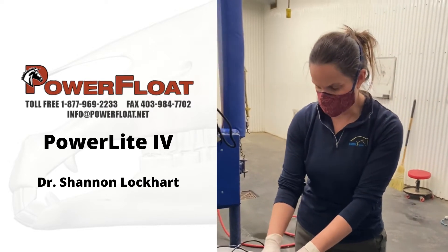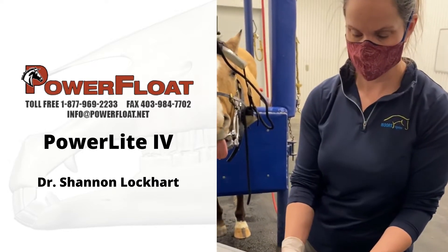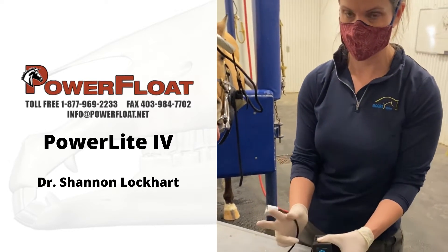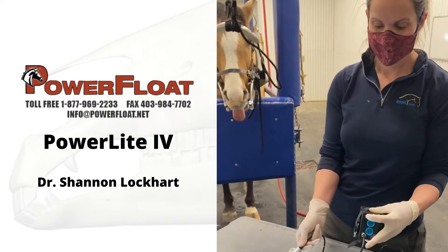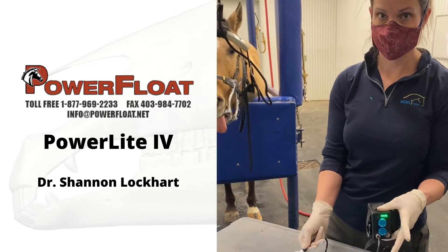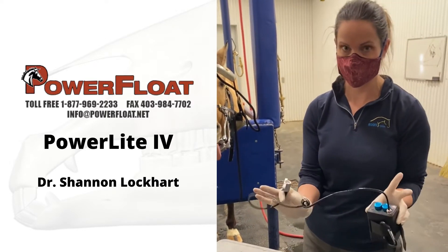To turn it on and off, there's a little button just beside those blue buttons right here — that's your on and off. There are two brightnesses: first click does the brightest, one more click dims the light, third click turns it off. So that's how the light works.